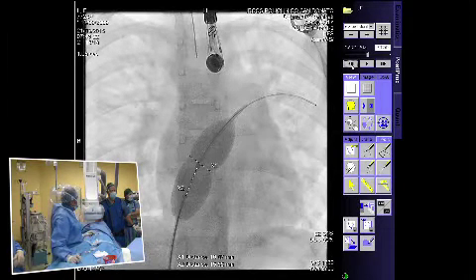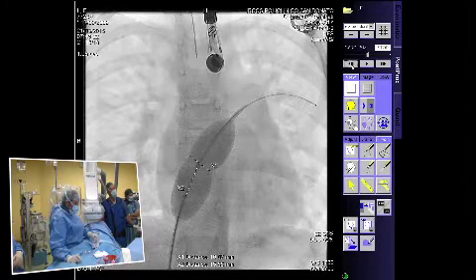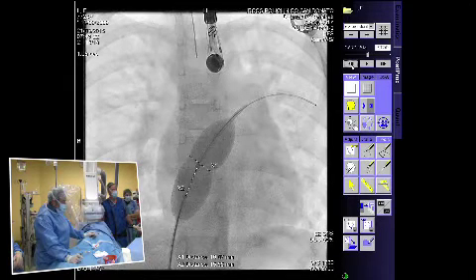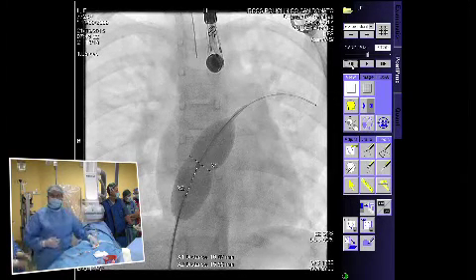Aki, would you comment on that? Yeah, I think you're absolutely right. There was an offload without the indentation. So again, I think 15 will be enough, but in this case we're pretty far from the tricuspid and mitral. I think 16 will be okay. Okay, Aki suggesting 16. Would you agree?